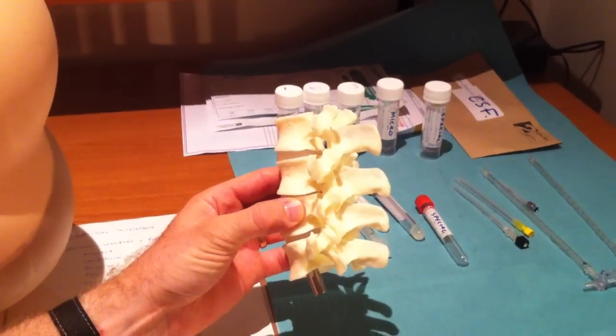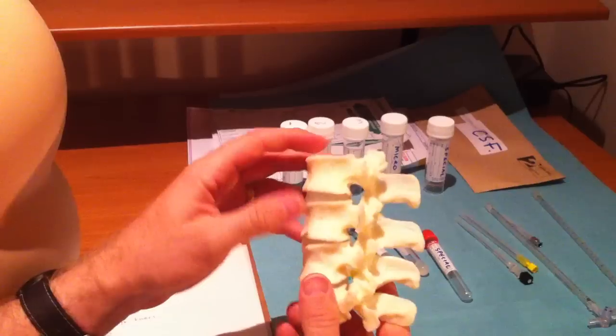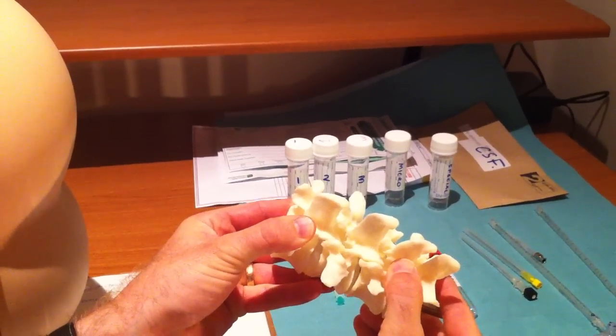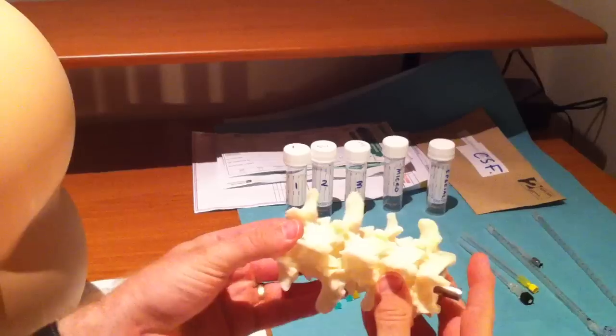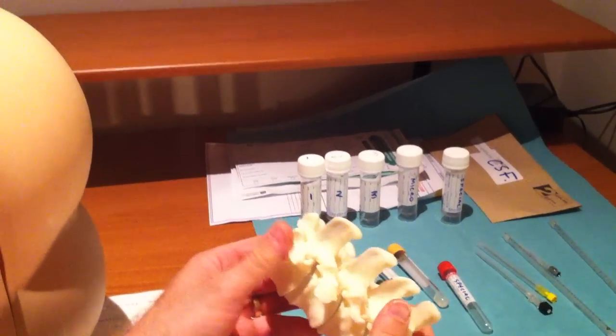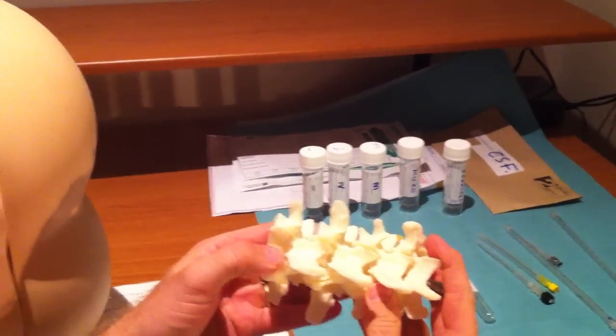The next thing to be aware of is what you're aiming for. This is a model of the lumbar spine. When the patient flexes, the spinous processes will separate, so you want the patient flexed to open up the spinal canal. If the patient is very nervous or tense, those spaces will close up and it'll be harder to get the needle in.